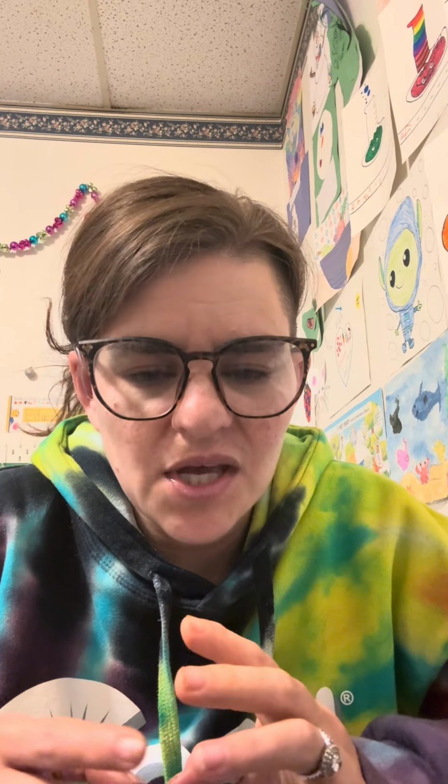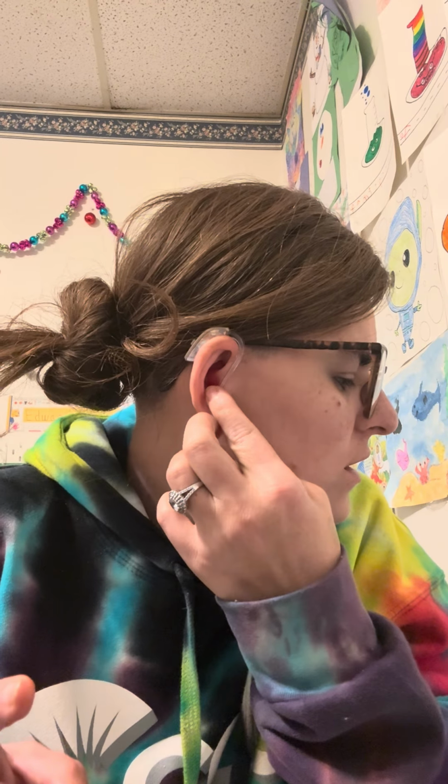So talk to your audiologist, and I definitely recommend, if you can, please do your own maintenance, because it makes it so much easier, so much faster, with fewer appointments, and a better hearing aid experience, in my opinion. And it makes it much easier on your audiologist, not having to schedule you just to change your tubing. As you can see, it's easy and fast.